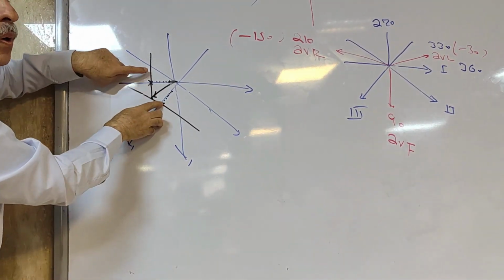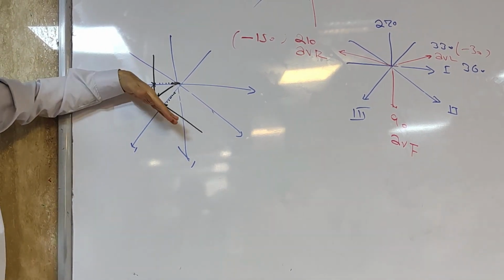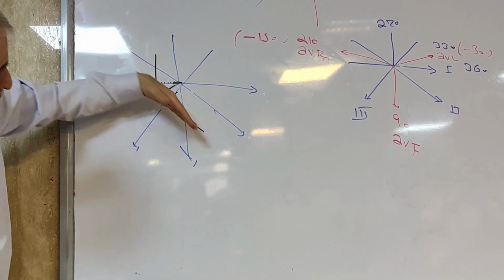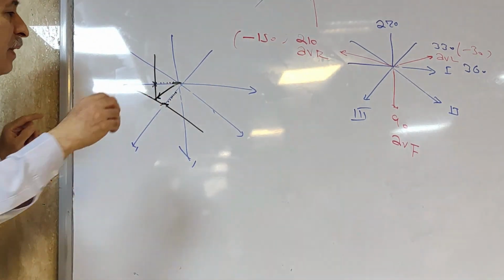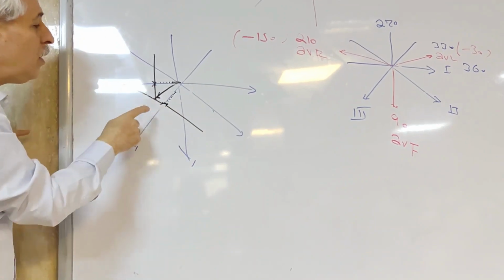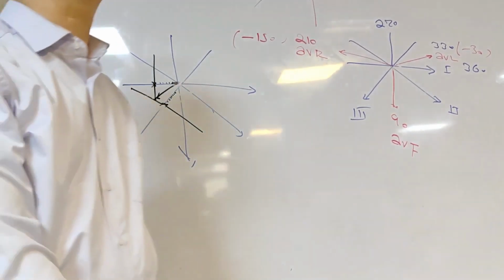We have 2 points. Make a perpendicular line to that respective lead axis, a perpendicular line to axis namely 3, and axis namely 1. When there is intersection of these perpendicular lines connected to the center, then that would be the mean axis.